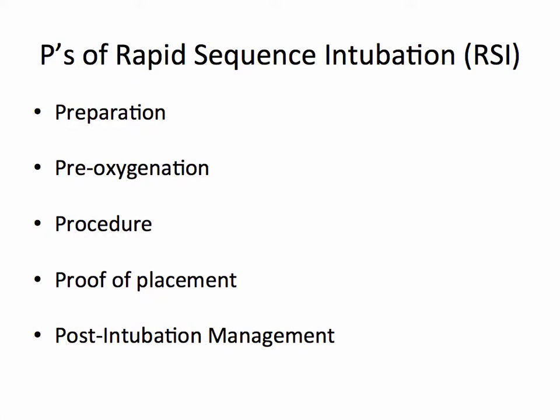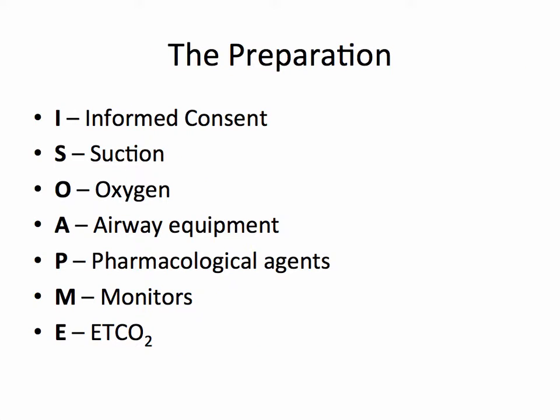The P's of rapid sequence intubation can assist in remembering the steps of intubation. These include preparation, pre-oxygenation, procedure, proof of placement, and post-intubation management. Preparation is the most important step for intubation. This step is especially important for the bedside nurse in order to ensure a well-structured procedure.